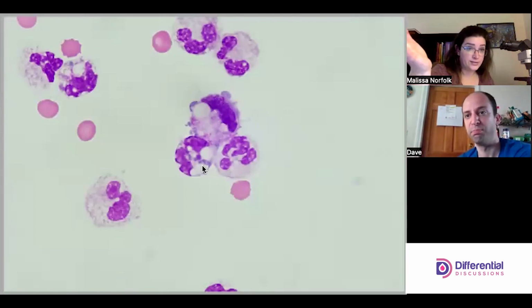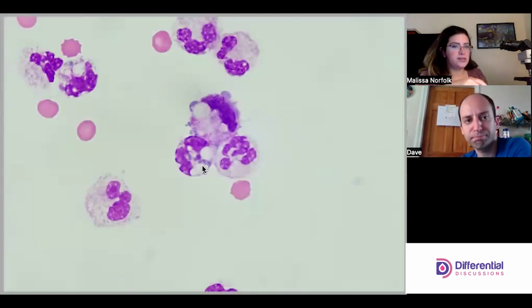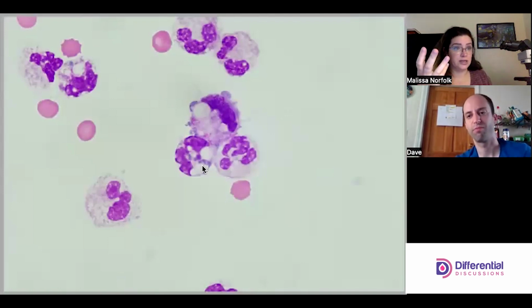And there are red cells. Typically, blue-black granules follow the bleed by a period of time, because they indicate that the red cells have had time to be broken down inside of the phagocytic cells. So you're not looking at a brand new bleed; it's usually an older bleed. But we're looking at a BAL.